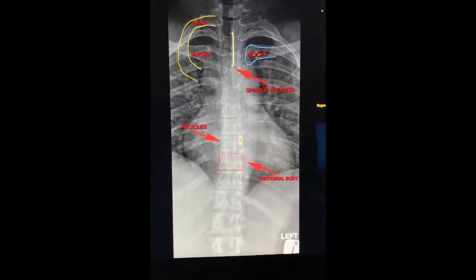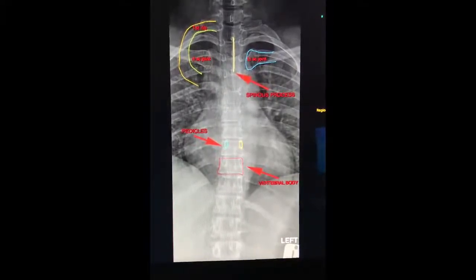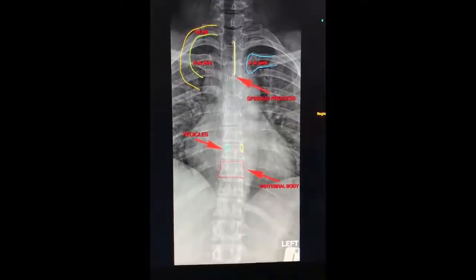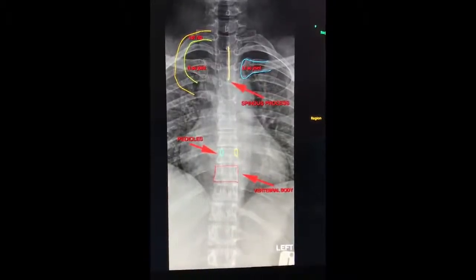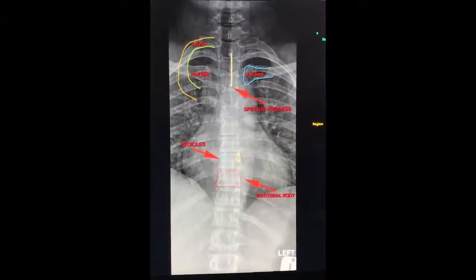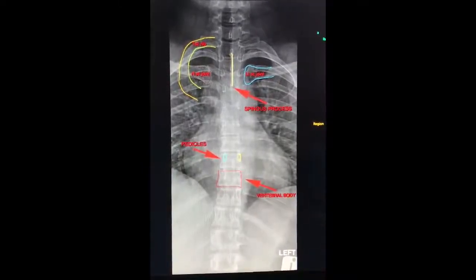Okay, when it comes to exposure, you should see even density in the upper and lower portions of the thoracic spine. Remember that we did mention to be able to achieve this, you can use your boomerang or wedge filters. Okay, so also with regards to your exposure, you should be able to see a clear demonstration of your bony margins as well as your trabecular markings. This is also an indication that there is no motion in your image.